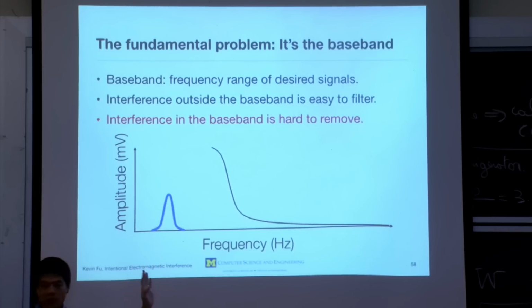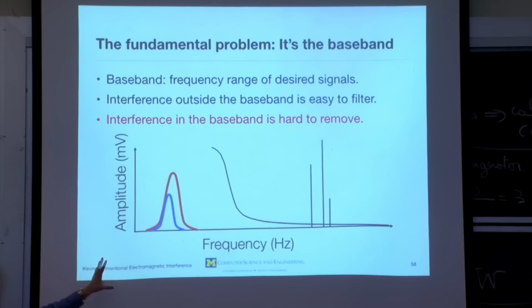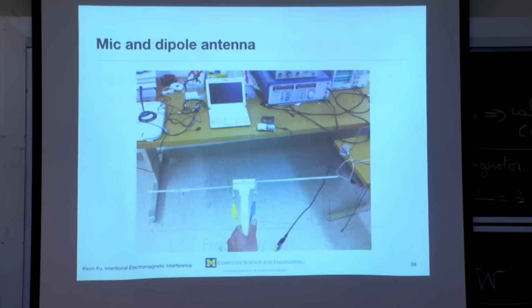So if your electrodes were to pick up some high frequency signals, you just put in some analog filters and you'd say, that cannot be real, right? If your heart's beating that fast, you're probably just picking up something like an electric mixer while you're making your lunch. So similarly, you can filter out pulses in the high frequencies. But if you send interference that's in the baseband, those filters are going to be meaningless, because those analog filters cannot get rid of it if it's in the same frequency area as what you're expecting. So it's hard to filter in the analog.